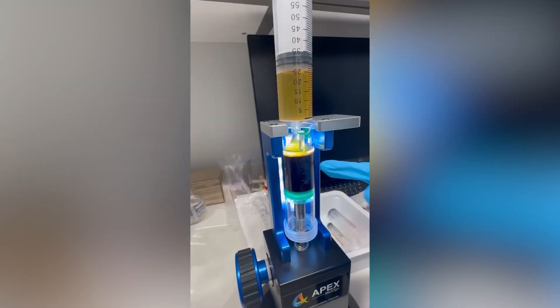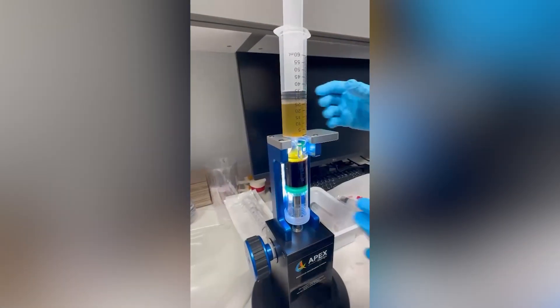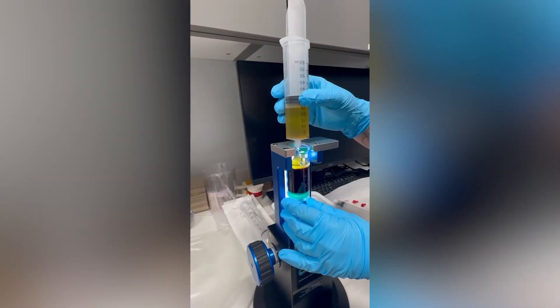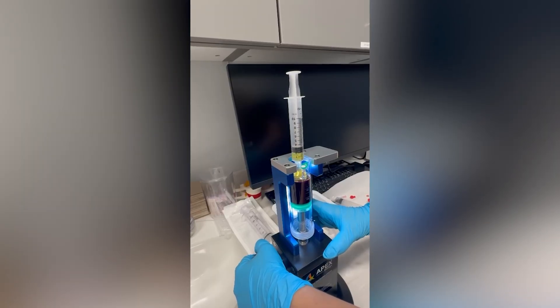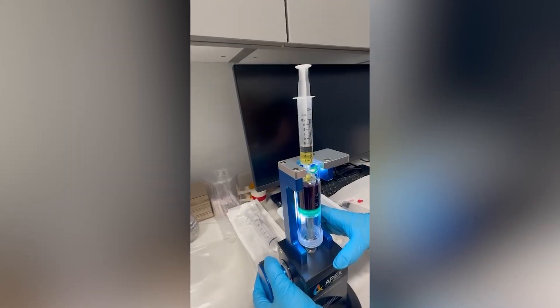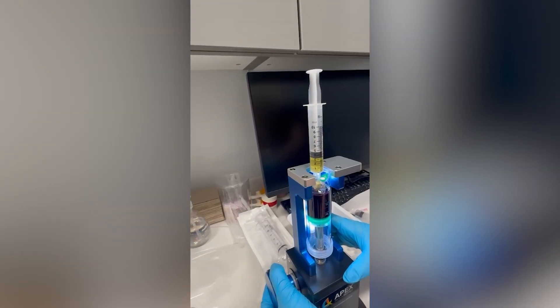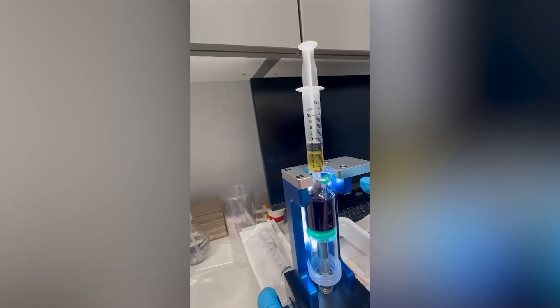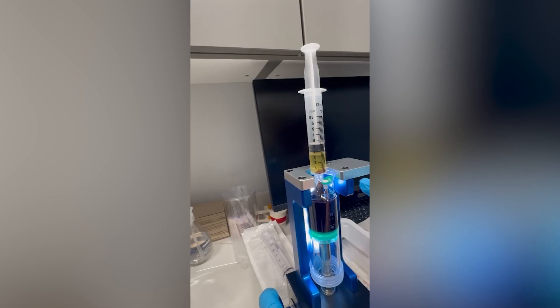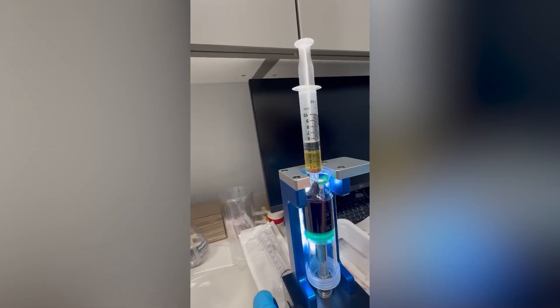So if I were to bring the Buffy coat to that 6 right there, switch syringes and put my injectate syringe on there, it would give me about a 6 ml injection. Right now you can see that Buffy coat coming up — really cool to see. You're going to get some red, but because you haven't gotten all the white yet — just like that — I would stop right there.